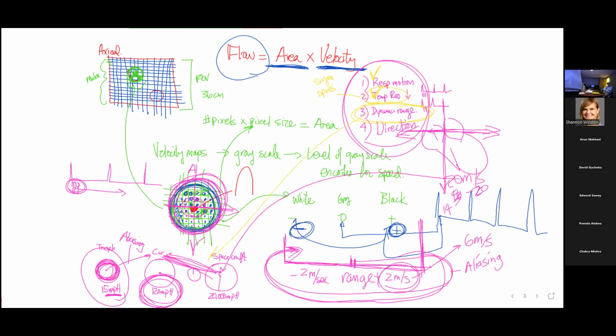Think about these speedometers. We've got the space shuttle, the car, and your child's tricycle. If you take this space shuttle thing and you're all excited and you take it home to your 4-year-old son and you stick it on this and they pedal their little hearts out and that thing doesn't move, they're sad. Okay? So you're going to be sad if you're a medical person and you pick the wrong one of these. We've talked about why. Either you get the aliasing because you make the thing spin around, or you don't set it so that you can actually even appreciate the right amount of velocity. Okay? So if your child's sad, you're sad. So we've got to get the dynamic range.